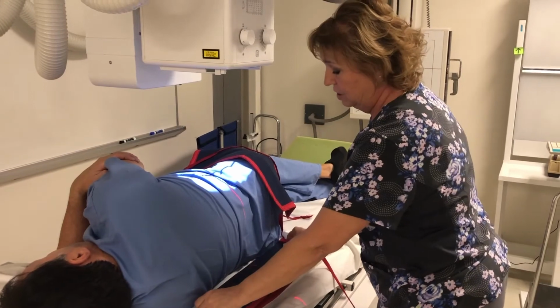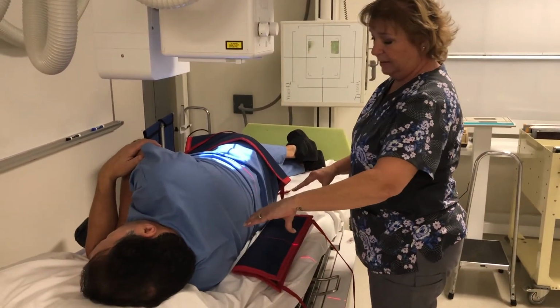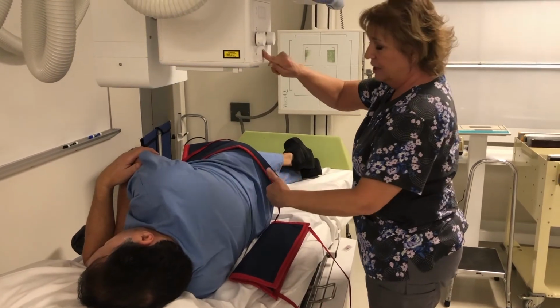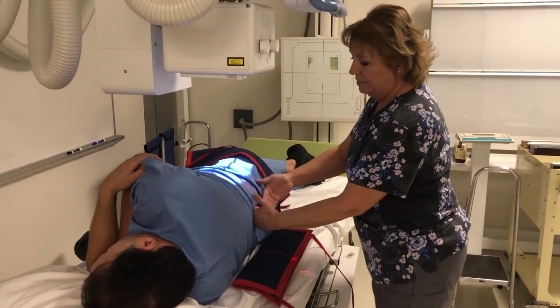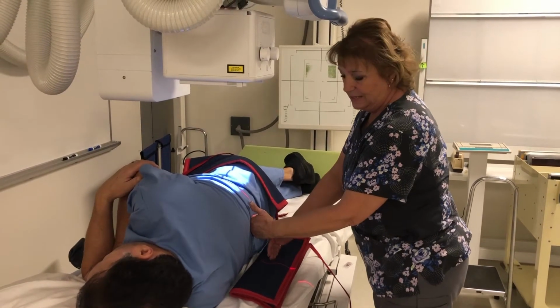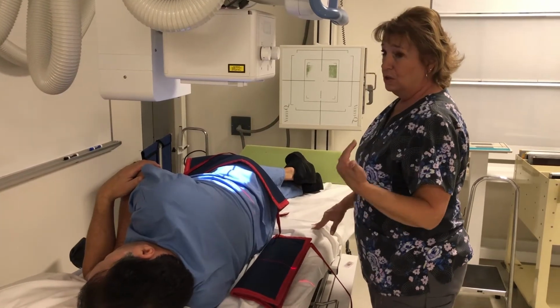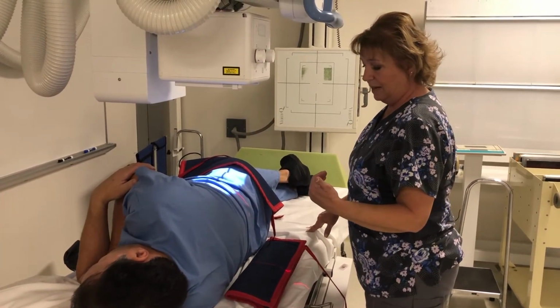So one of the things you can do to block the scatter is to put lead shielding right behind the patient, and that will absorb the scatter radiation that his body is creating and prevent it from hitting the image receptor. So it drastically improves image quality.